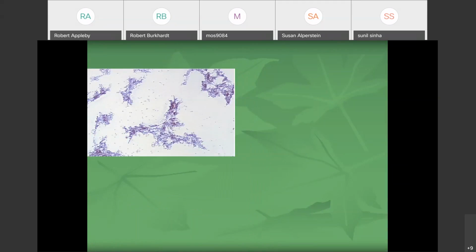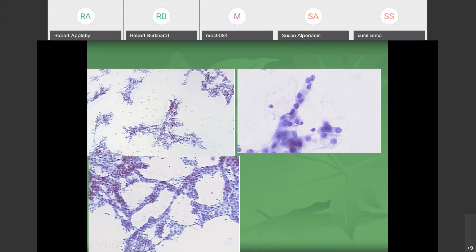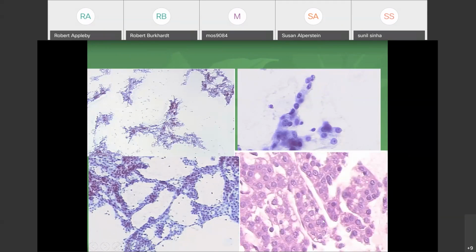And when I was in NYU, I had cases like this. It was a granular smear, have trabecular, but there's no endothelial lining. You have reduced cytoplasm, but no endothelial, and the lesion was previously called reactive liver, and then it shows up in bone metastasis. So I went back to the original case. I recognized this was not described in cytology literature.